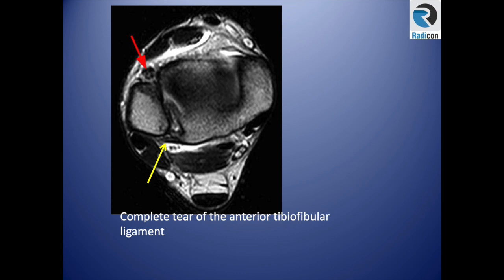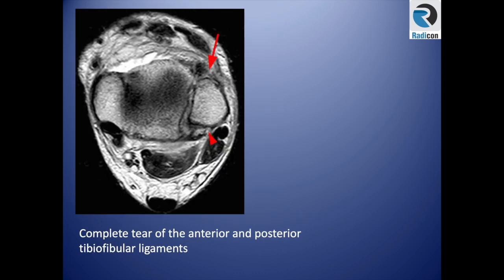Another case: on the axial image at the level of the D-shaped fibula — at the level of the syndesmosis — there is complete disruption of both the anterior and posterior tibiofibular ligaments, indicating very high instability of the syndesmosis.